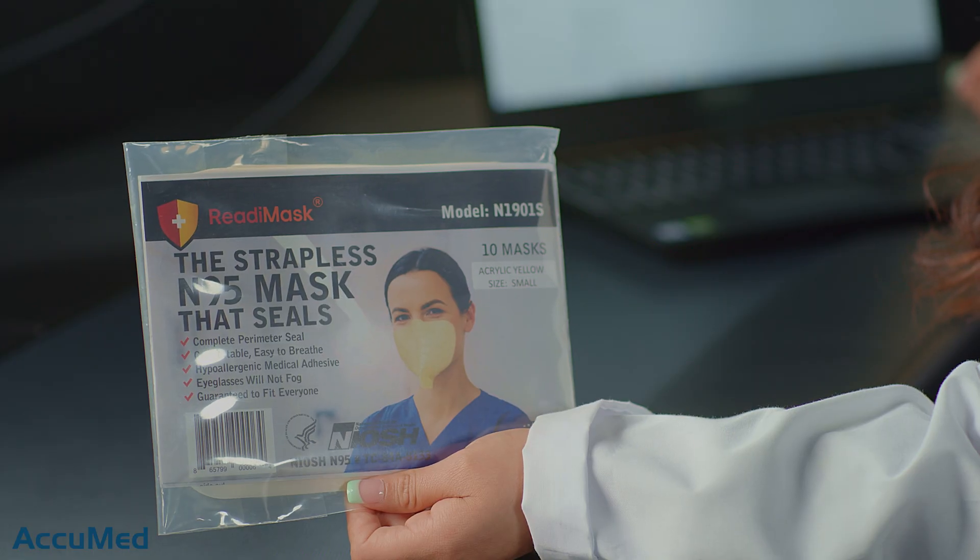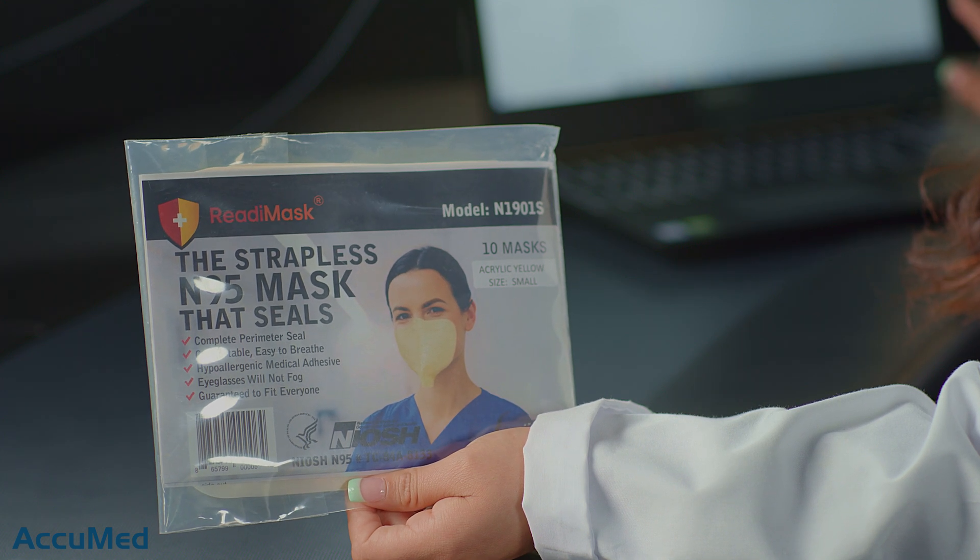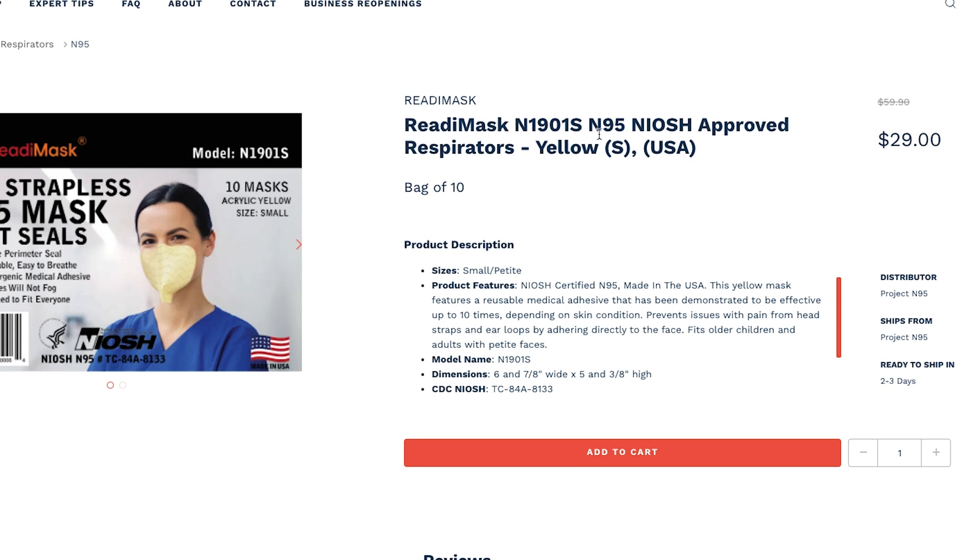Hello everyone and welcome back to the AccuMed channel. Today we're going to be reviewing the ReadiMask Strapless N95 respirator. These are made in the US, and I'm really excited to try these because they have a very interesting design — they are the only respirator we are aware of that are strapless. These are the ReadiMask N1901S N95 respirators.